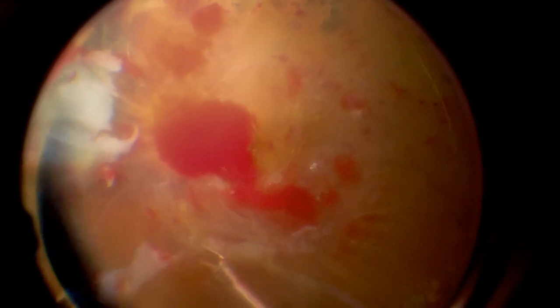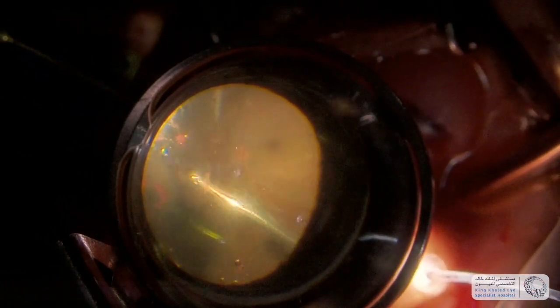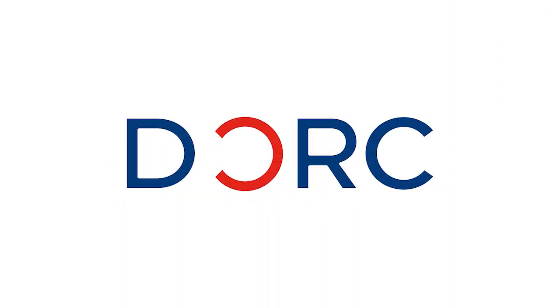Having a chandelier light inside the eye is like having a third hand, so you don't really need an assistant to manipulate and depress for you while shaving, and in most cases you don't even need to suture.